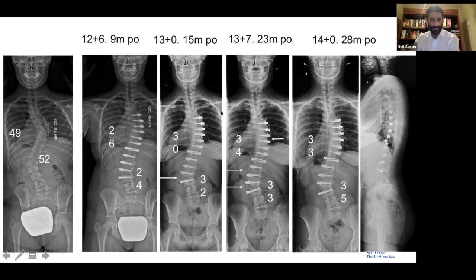Ideally, obviously, one of the things you look at in these lumbar curves is the tethers probably break a little bit sooner because there is more motion. And I know she was very active post-op. And also there's the weight issue that you brought up earlier. So these heavier patients tend to break their cables a little bit sooner. From what I've seen, a few of my tether breakages seem to be more in the heavier set patients. We'll see what the literature shows on this as we move forward too.